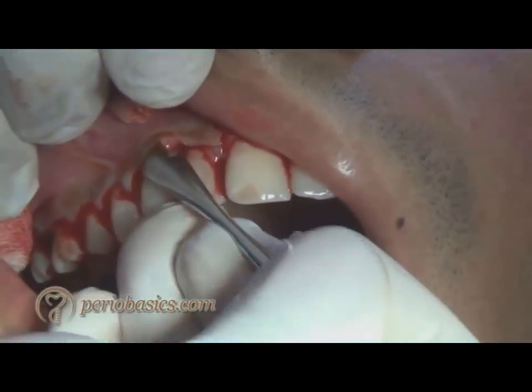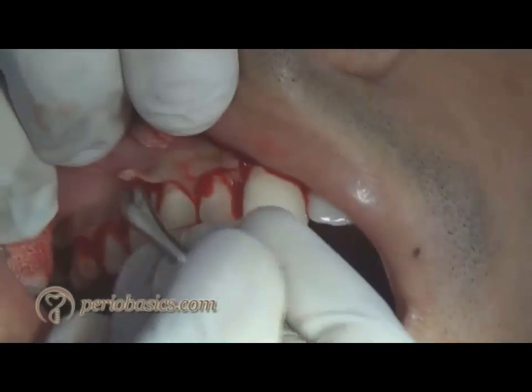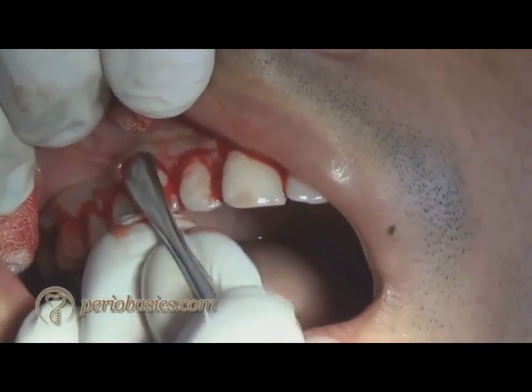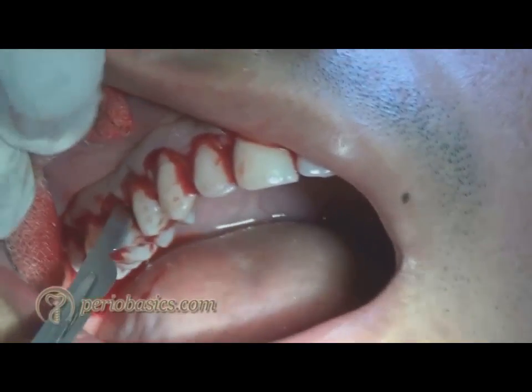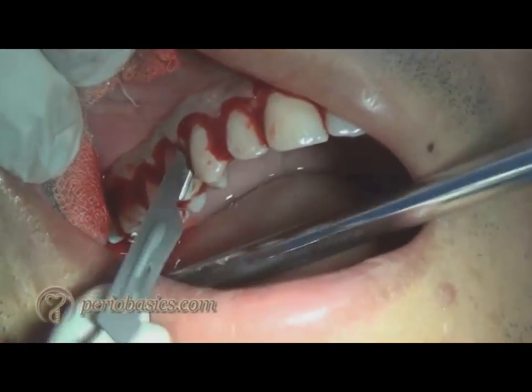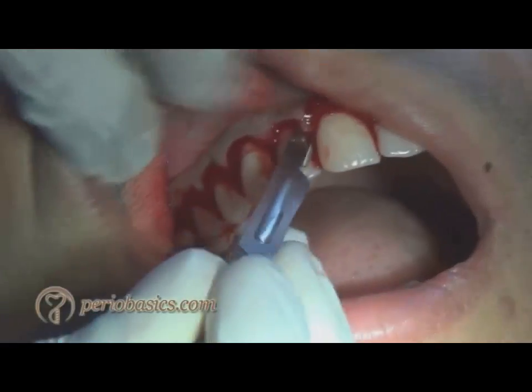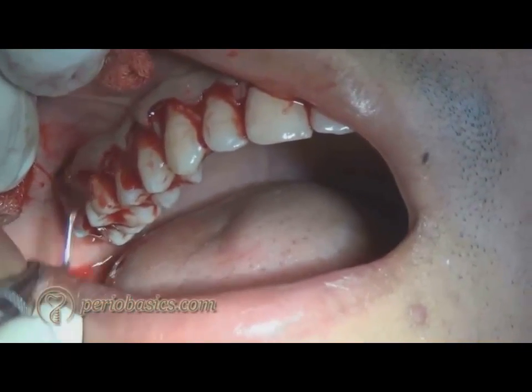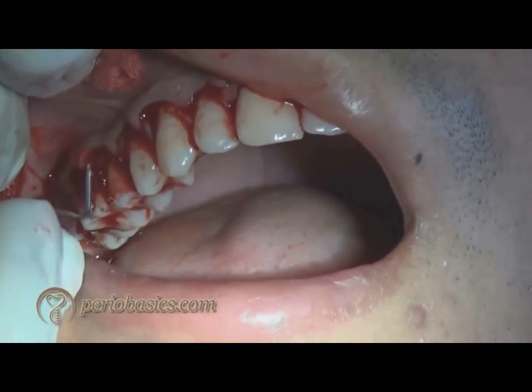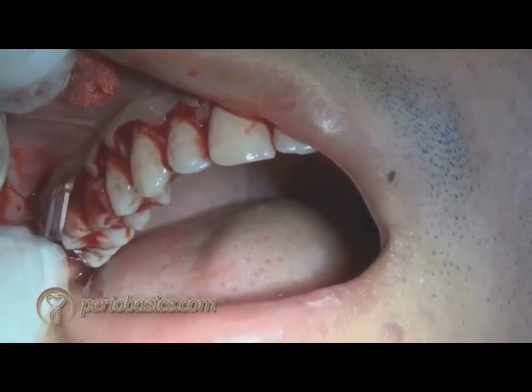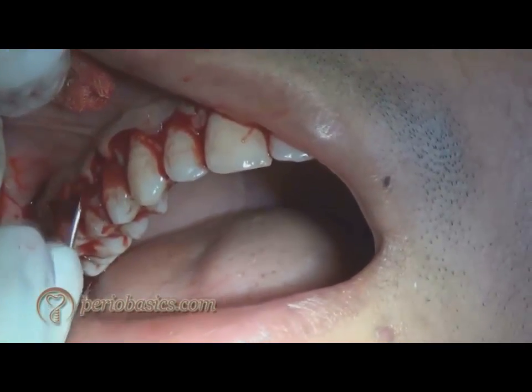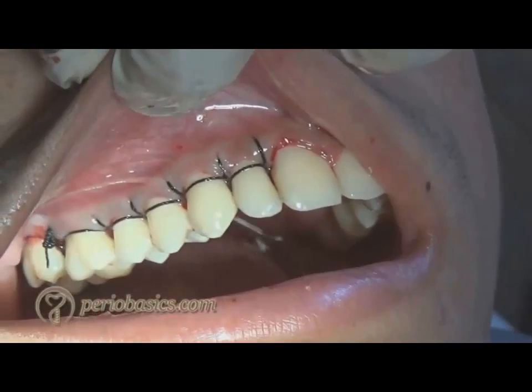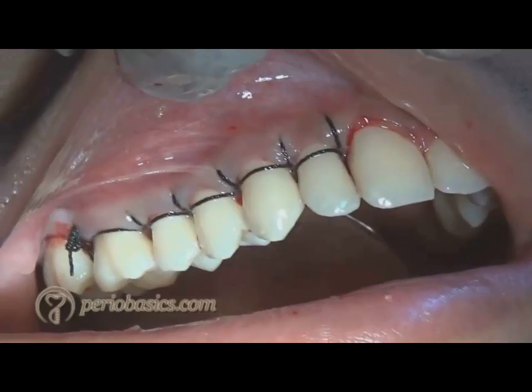The first or initial incision is the bevel incision, and now he is trying to separate the cut tissue from the attached gingiva. After that, he is doing an intracrevicular incision, the same as in the previous video. There is a third incision — the horizontal incision — but the dentist did not perform it in this case. He introduces the scalers to remove the infected tissues and soft tissue that has already been cut. The main idea of the Modified Widman Flap is to give easy access for scalers between the teeth. After you are done, you suture it back to its normal position.